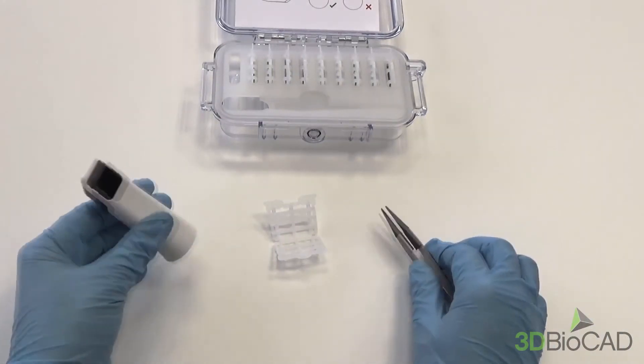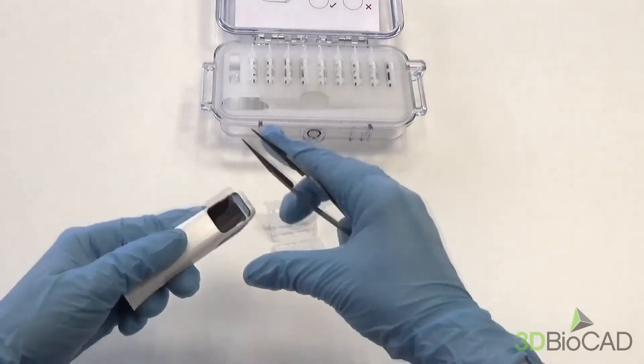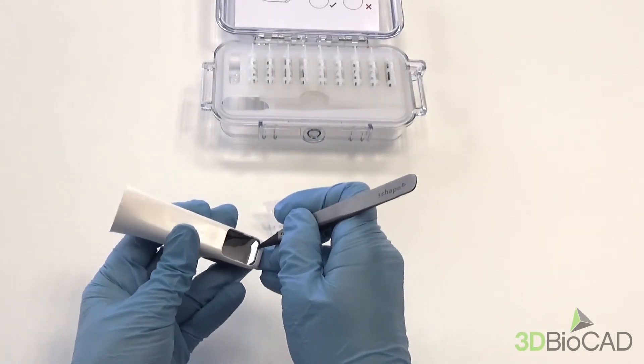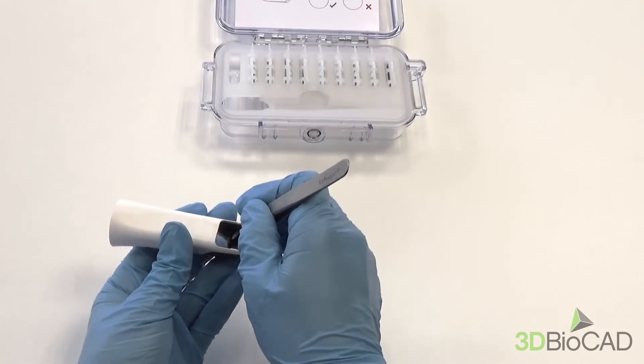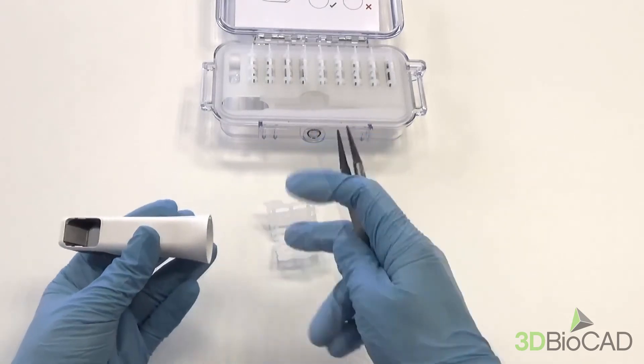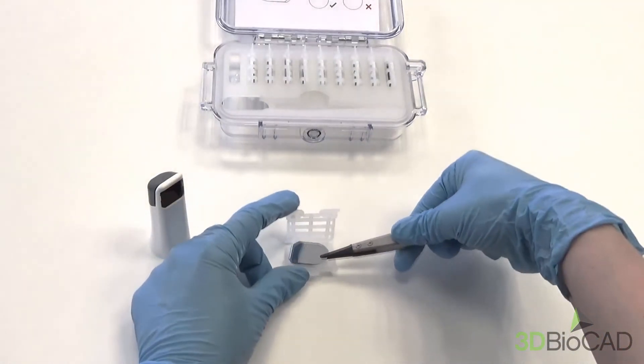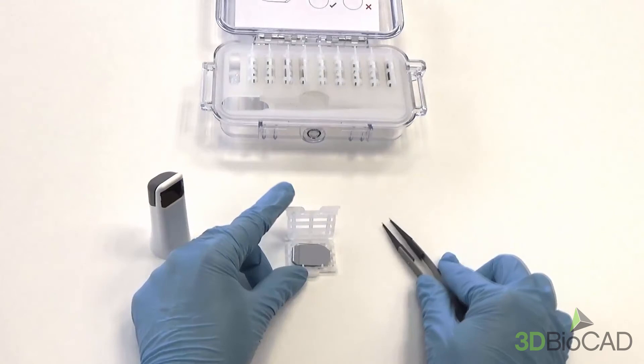To remove the mirror, take the tweezers and push the front edge of the mirror, then gently slide it down. Put it in the package and replace with a new one, doing the exact same thing as shown before.